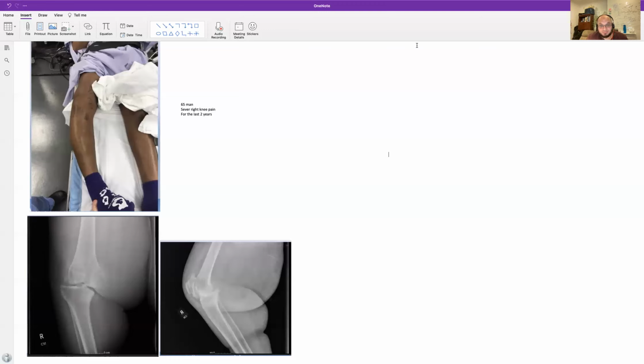my go-to option. As a general rule, with any degree of constraint or augmentation for bone substitution, I need to use a femoral and tibial stem on either side. And based on the patient's medical comorbidities, I will involve other specialties.